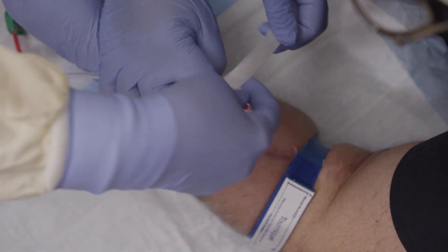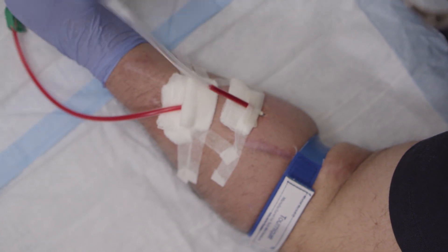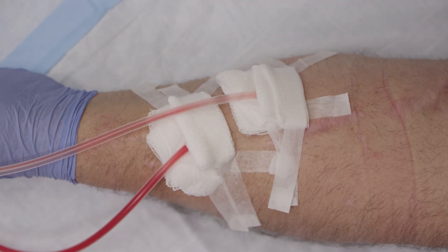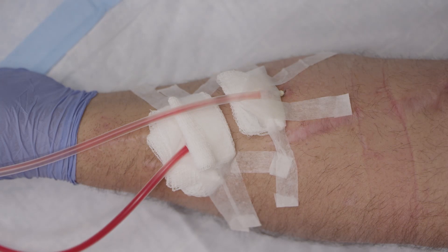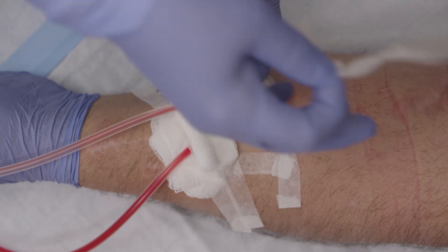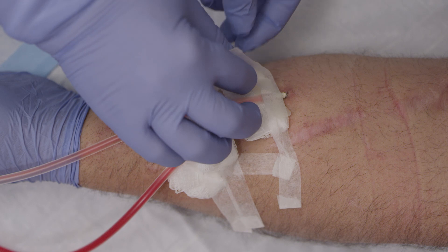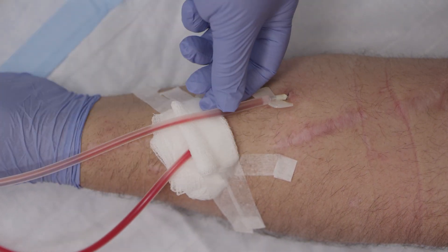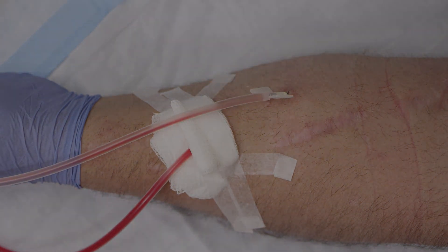Repeat the previous steps to access the second site and then initiate dialysis per your center's protocol. To remove the fistula needles after the dialysis treatment is complete, put on clean gloves. Remove needles at the same angle of insertion using one fluid motion, one needle at a time. Wait to apply pressure to the site until after the needle is removed. It is best to use two fingers to apply pressure over both the vessel and puncture site. Dispose of the buttonhole needle into an approved sharps container.